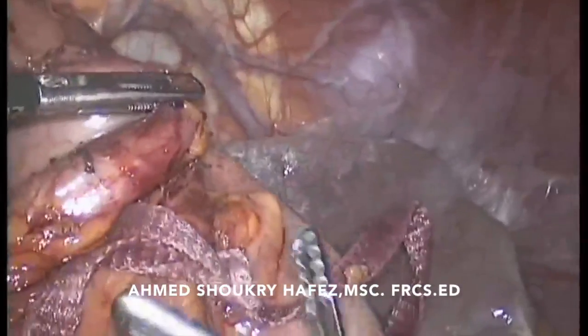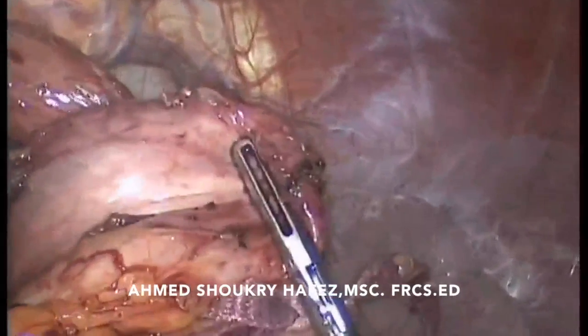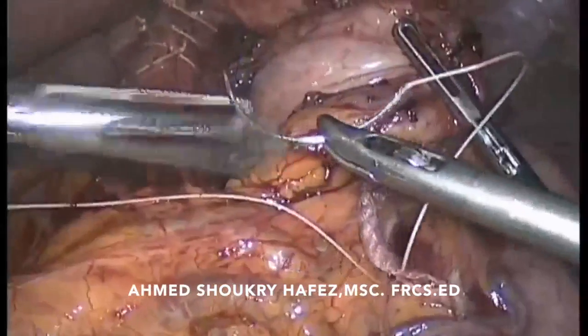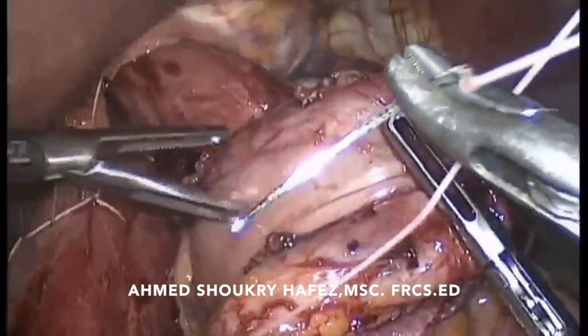Now the assistant will fix the wrap after we have positioned the wrap in its anatomical way around the lower end of the esophagus, and I will fix the wrap posteriorly to the crus.